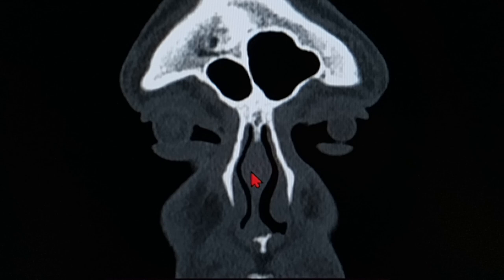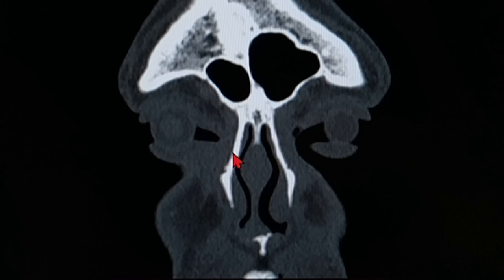This you can consider as important in cases of septoplasty, but you can see there's no bone over here. This is purely cartilage. So if you want to decongest the area, the swelling may decrease if you try to decongest that with your decongestants, okay? So still going on behind, it's still the same structure becoming more prominent. You can still see this perpendicular plate of the ethmoid.